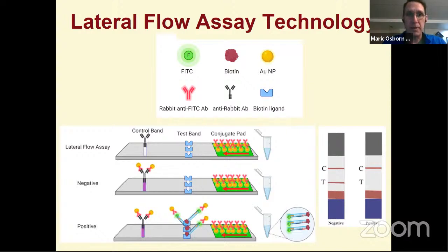If the molecule is not conjugated with both FITC and biotin, then nothing is captured at the streptavidin or the test band and is read as a negative result. And so the analyte has to be marked or labeled with both FITC and biotin in order for a positive signal to be observed. And so really the labeling of that was what my laboratory was interested in pursuing, and doing so in a way that would make it feasible for use by any academic or clinical laboratory using commercial reagents.